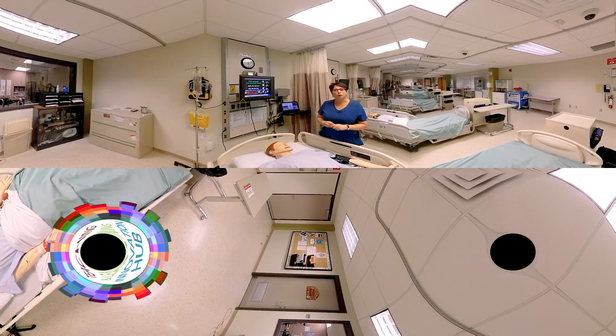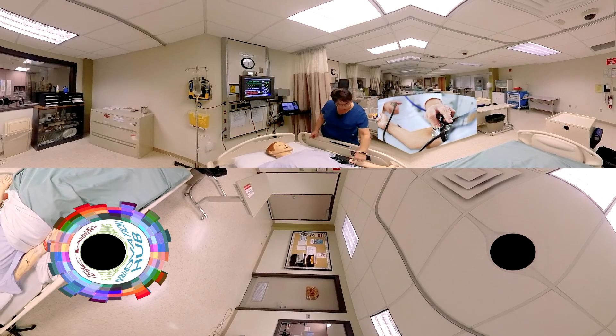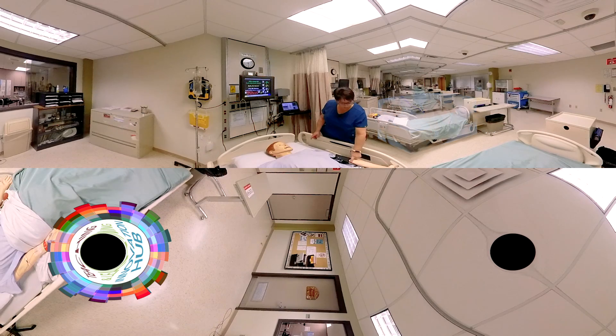The other thing you have to remember when using the mannequin is your stethoscope does not go directly where it would normally go around the brachial pulse. It goes lower on the mannequin, in the center of this pad area here. You need to put it there — that's where the mechanic is in order to hear your blood pressure.